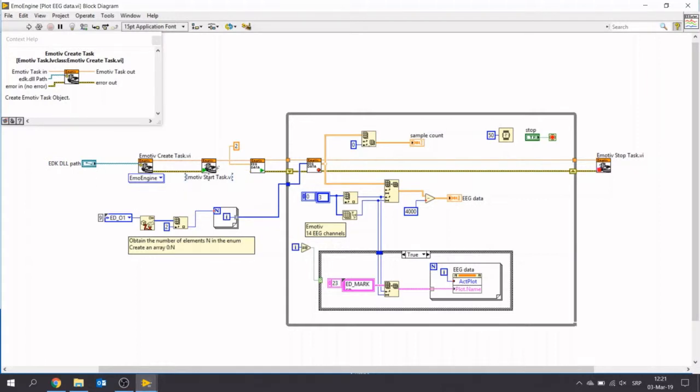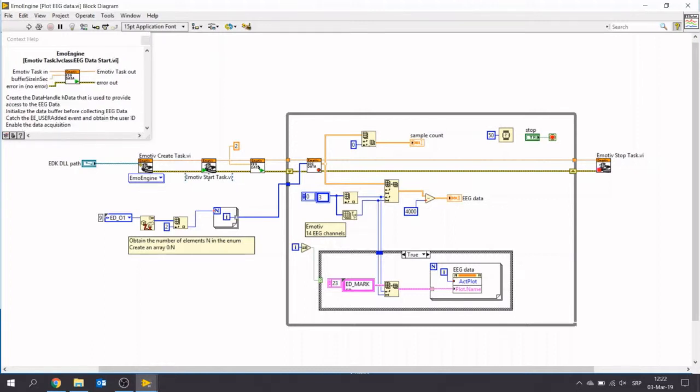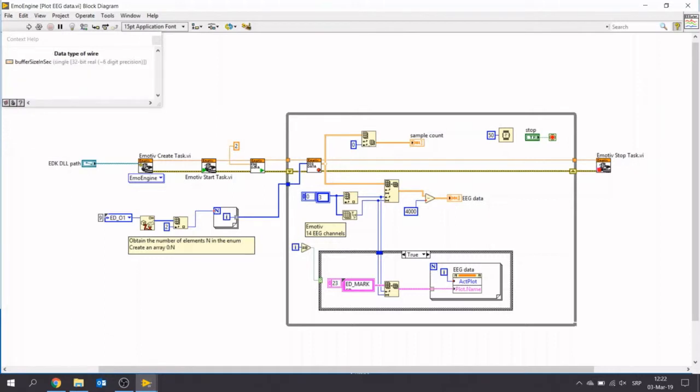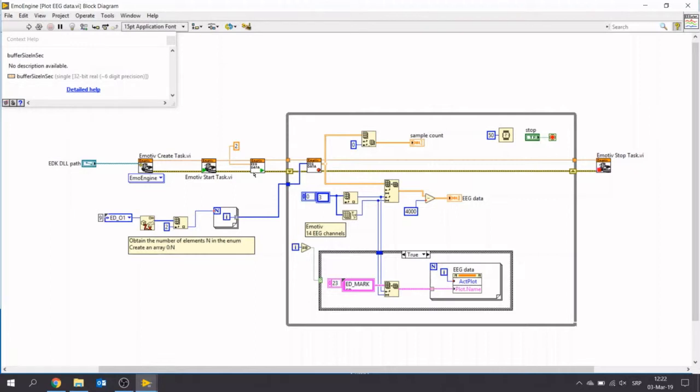After that, we need to start Emotiv task. And in this part of the program, we are connecting to the device we have, so Emotiv. Third step is start data acquisition. We initialize the buffer and we say how much is our buffer size in seconds. So in this way, we are going to hold only 2 seconds of data.